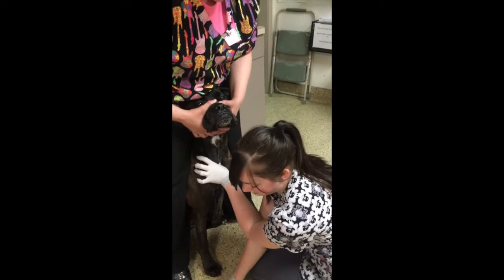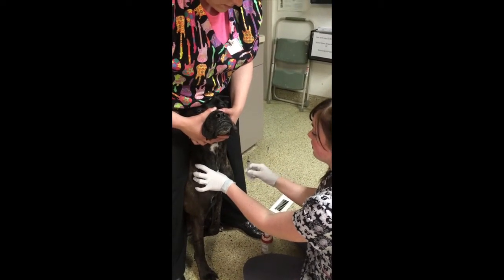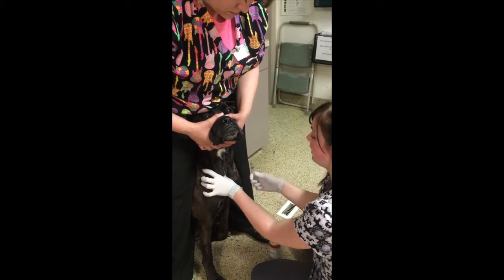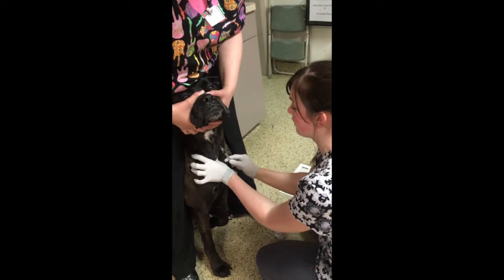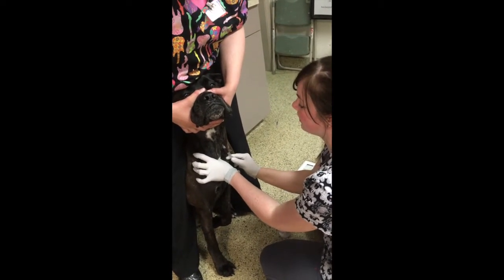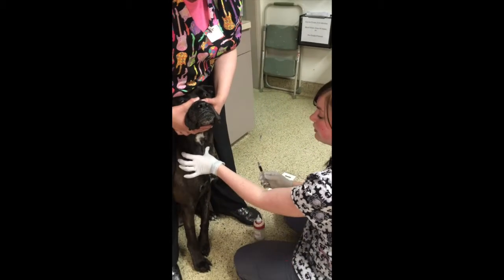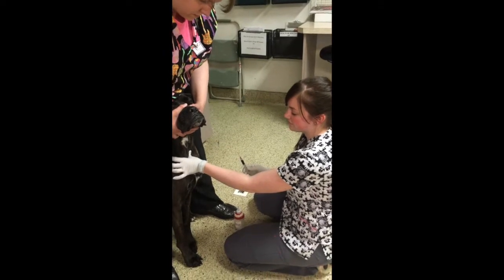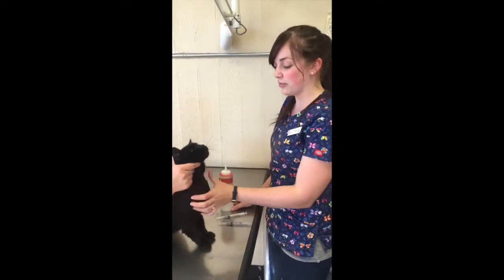Remove the cap on my syringe. Make sure my bevel is up, and then I'm going to go ahead and insert my needle. Once I've obtained the sample, I'm going to let go of her thoracic inlet, put my finger over where the needle was, and apply pressure for a few seconds. And we're all done.